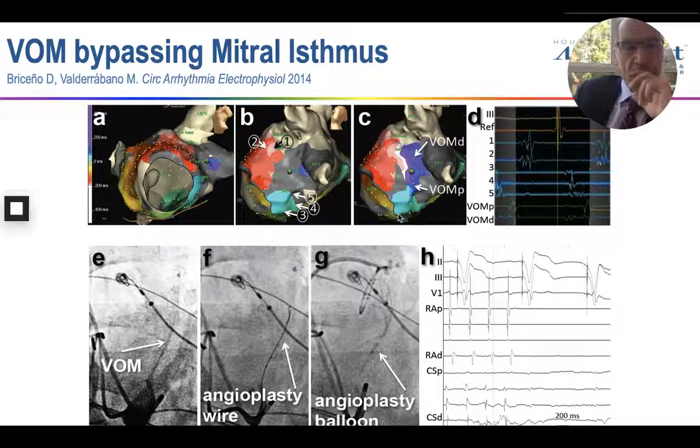There were cases where the patients had been ablated before, and patients came back with perimitral flutter. We could try to map the circuit, and it appeared either a focal arrhythmia arising from the mouth of the appendage and rotating counterclockwise along the mitral annulus, or perhaps a reentrant circuit where we were missing the last third of the tachycardia circuit that was missing in the scarred mitral isthmus.